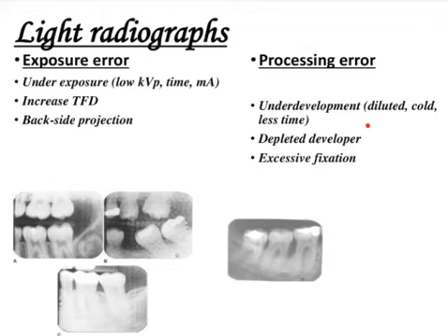But in the case of powder or liquid concentrate, when you mix with distilled water, it is possible that sometimes you end up making the solution underdeveloped. In such a case, if you see a light radiograph, then it means that the concentration of the solution has to be increased. So you need to top up the solution with a little bit more concentrated solution.